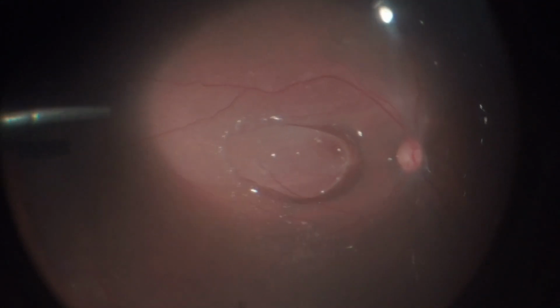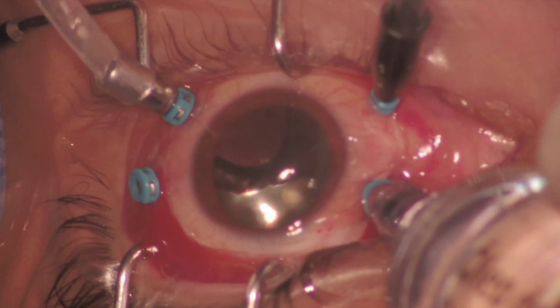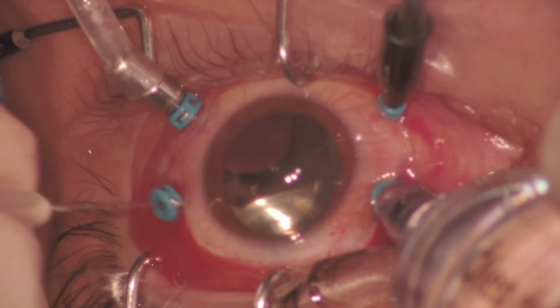After a fluid air exchange and complete aspiration of the perfluorocarbon, it is evident that the bubble disappears. Given the scenario of inferior detachment with signs of chronicity, the surgeon opts for silicone oil as a vitreous substitute.